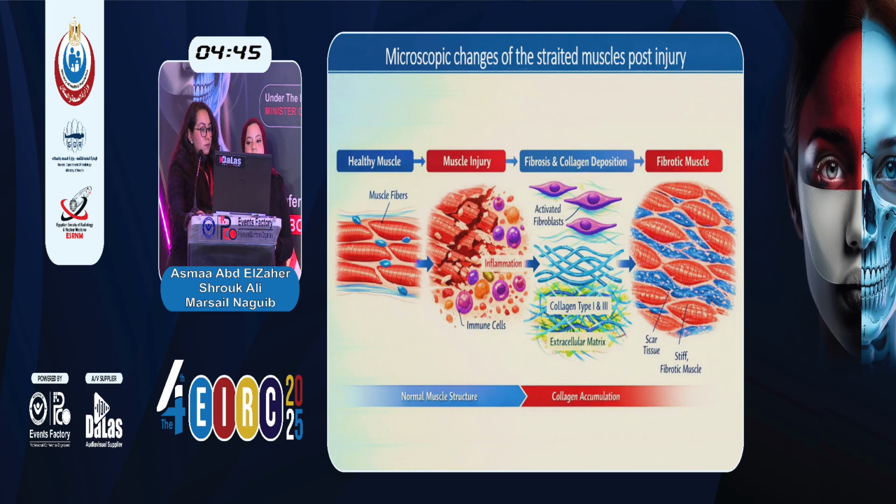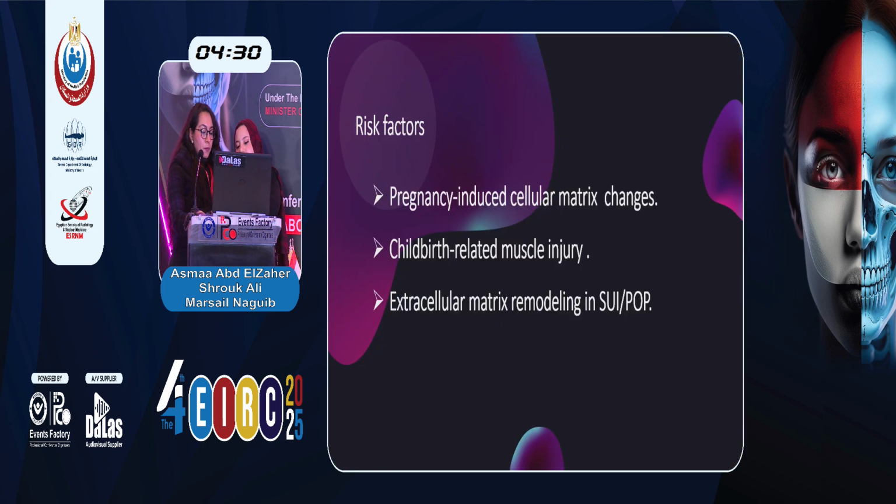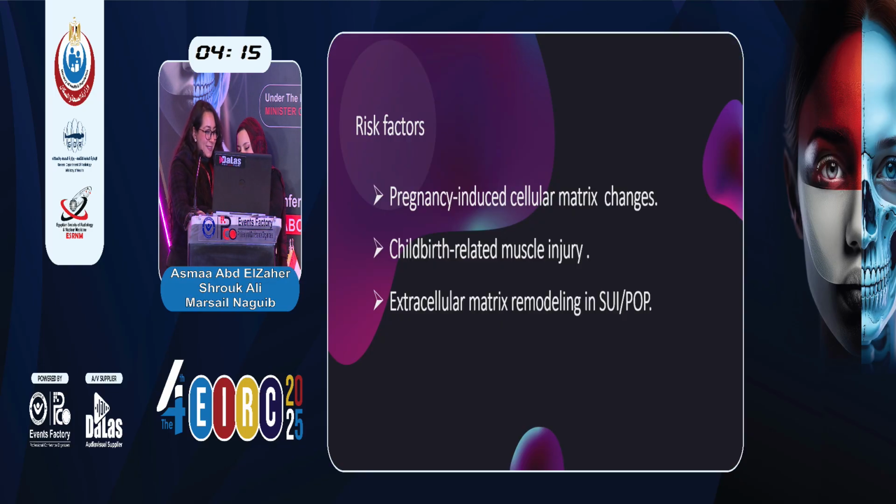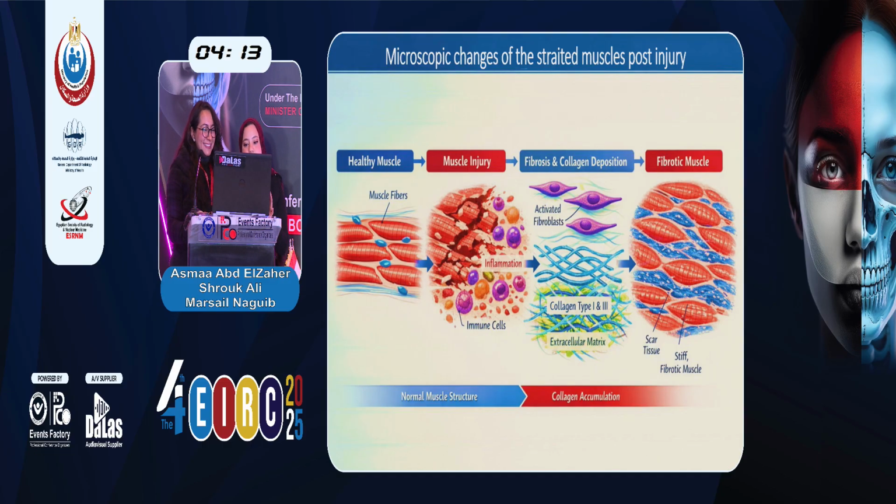Any micro injury, whatever the cause, will lead eventually to collagen deposition. The collagen fibers are more highly organized and with very directional orientation more than the normal muscle fibers. So this means more boundaries to water diffusion, decreasing the ADC. And this restricted diffusion will be more in a specific direction, elevating the fractional anisotropy. So even though the function is worse, diffusion becomes more anisotropic.